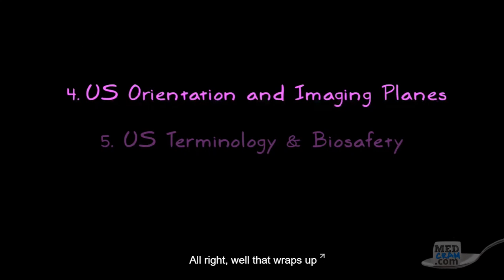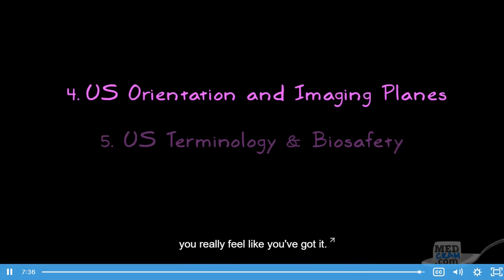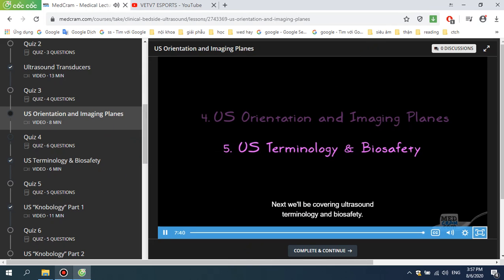All right, well that wraps up ultrasound orientation and imaging planes. This is a very important concept as you begin scanning, so if you didn't feel you caught those concepts the first time around, please watch the video over and over again until you really feel like you've got it. Next, we'll be covering ultrasound terminology and biosafety.